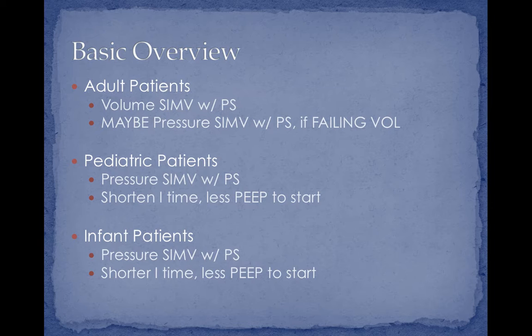And before I get started, I know everyone was really excited about PRVC. It is a very cool mode of ventilation. It's a cool breath type. It's a cool way to treat critically ill, very sick patients. But before we even discuss PRVC, we need to thoroughly understand volume and pressure control ventilation, how they work, when we would use them, how to augment them, how to troubleshoot them. So from this point, we're not going to discuss PRVC as a mode of ventilation until we get closer to the end of this program.